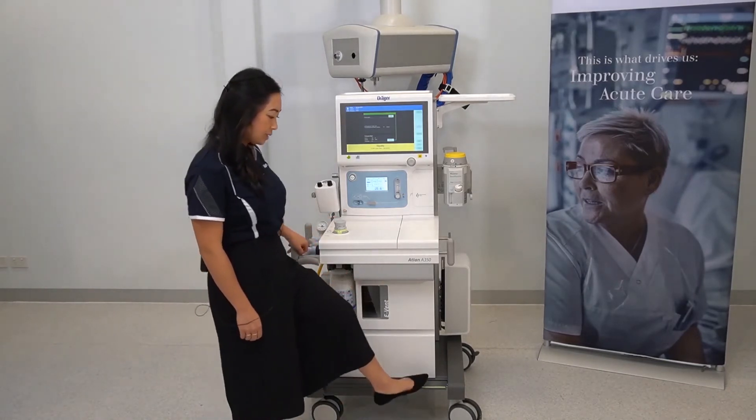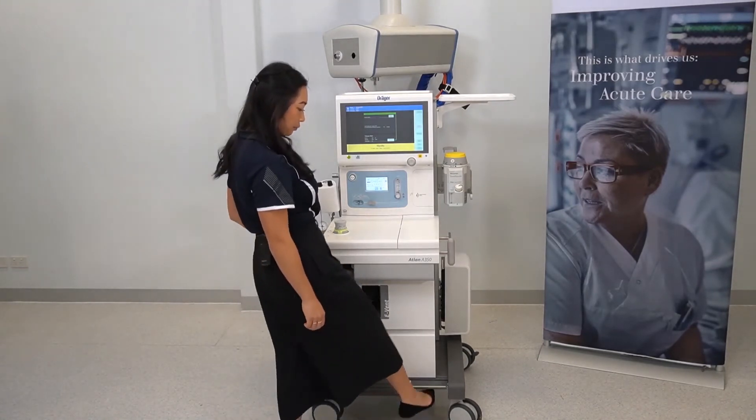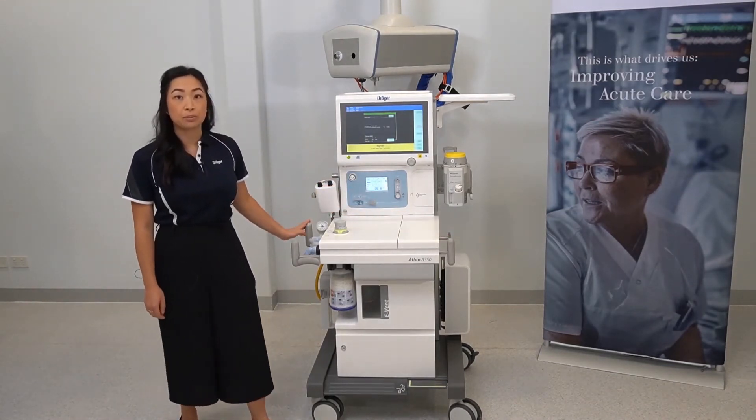To lock the device, push down, and to unlock it, lift the flap up. On either side of the device are handles which should be used when moving the machine.